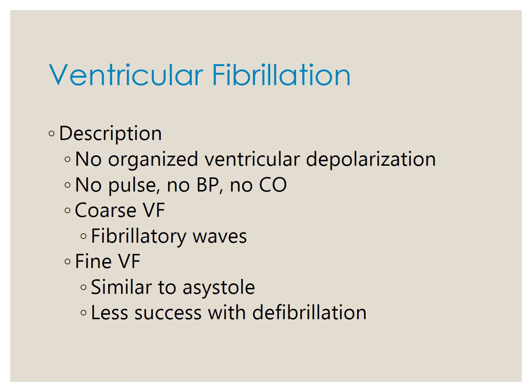All right, ventricular fibrillation. This is no organized ventricular depolarization. So imagine shaking a bowl full of Jello, and that is your ventricles that are going on. The patient does not have a pulse, does not have cardiac output, or a blood pressure. Okay, these patients are unconscious.